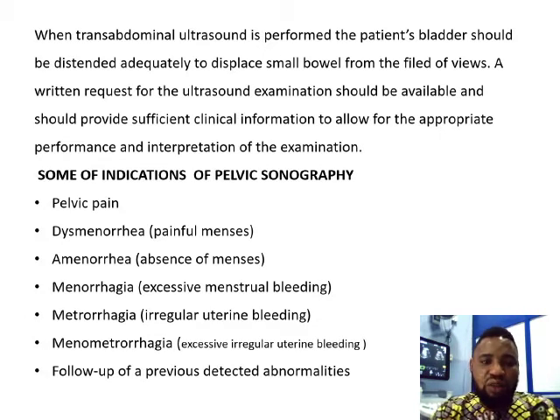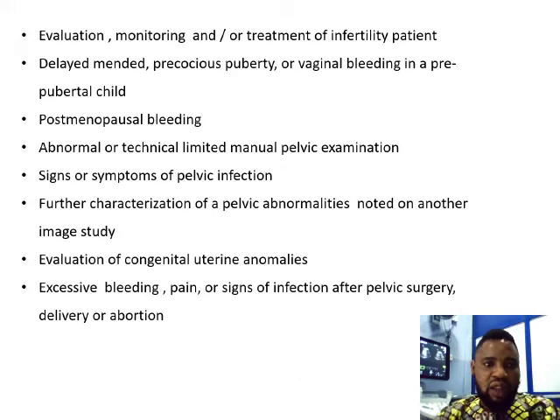Some indications of pelvic sonography. The first one is pelvic pain, dysmenorrhea, amenorrhea, menorrhagia, metrorrhagia, and follow-up of previously detected abnormalities. Evaluation, monitoring, and the treatment of infertility patients.